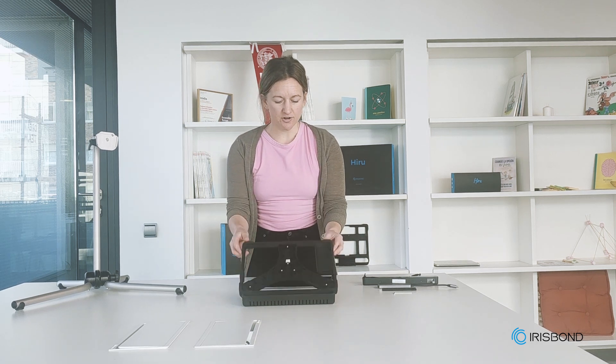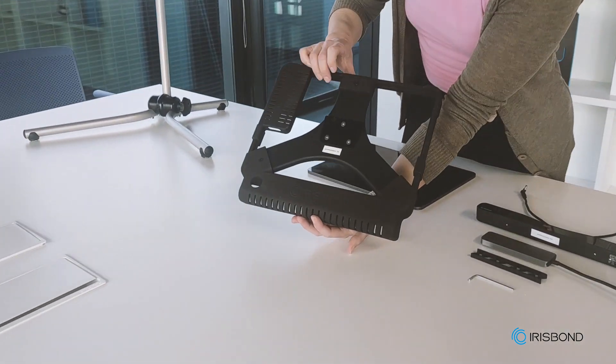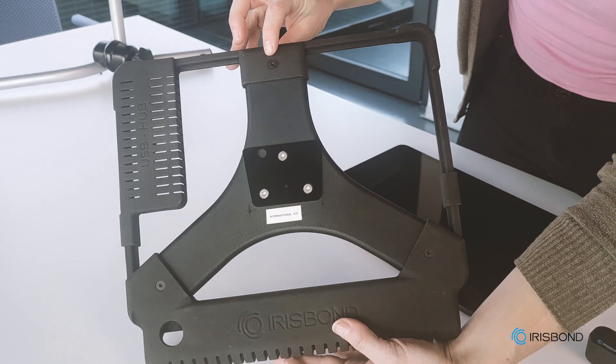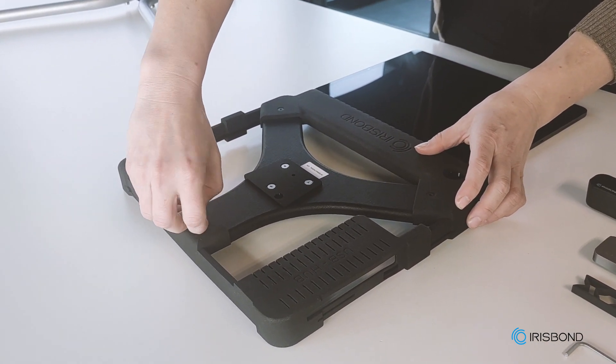Today let's look at how to put together our new version of the Osco for the iPad. So here you have your Osco — it should arrive set together like this. The first thing we're going to do is take out the screw here. This is the only hardware that we need to remove in order to set up our Osco.